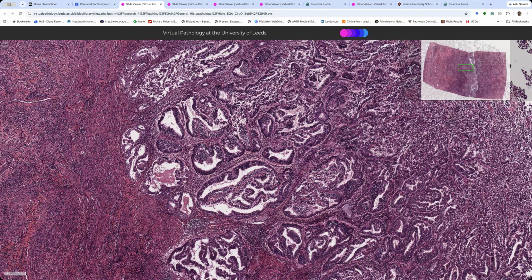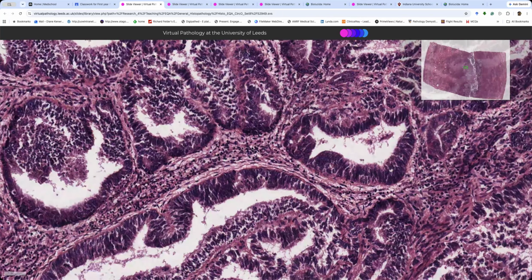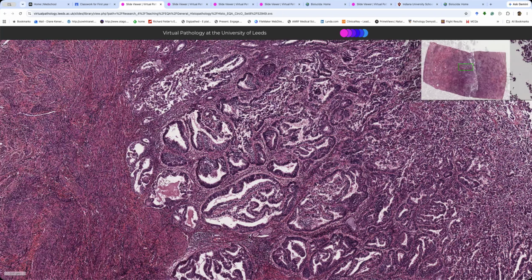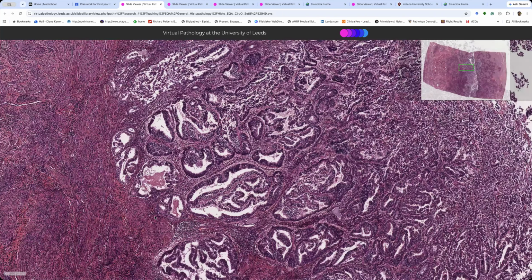Is there a desmoplastic change in the endometrium that will help us decide whether it's invasive? Probably not. Is there atypia above grade 1? No, there isn't. So are we going to call this bit atypical hyperplasia, or are we going to call this bit invasive? This is where it becomes hard and there are doves and hawks. If it looks like that, I would like it to please be treated like grade 1 endometrioid adenocarcinoma.